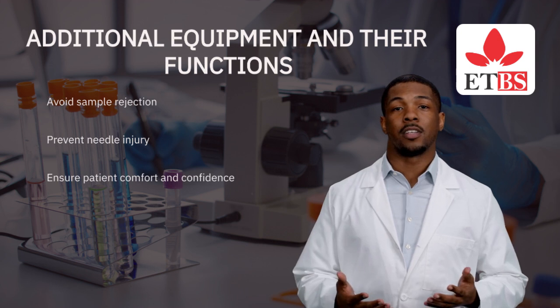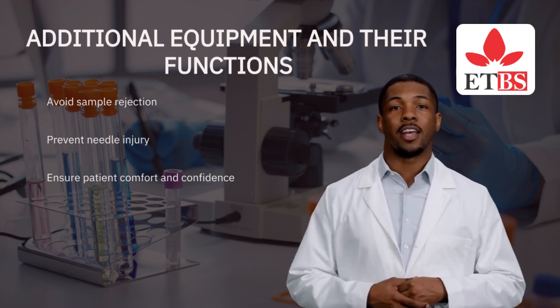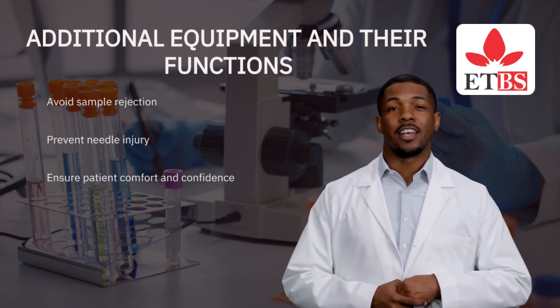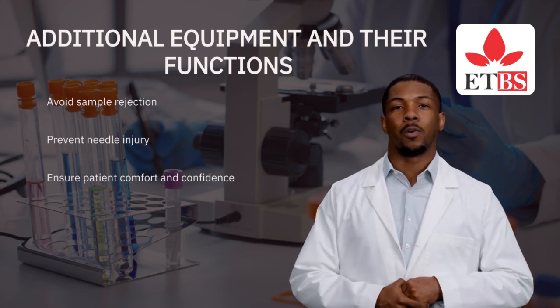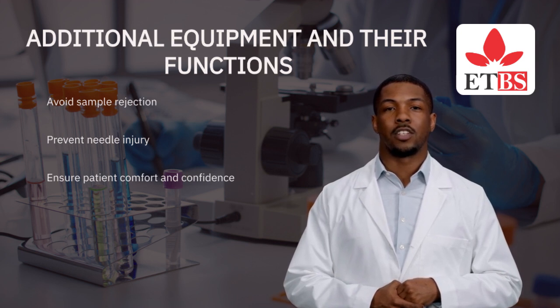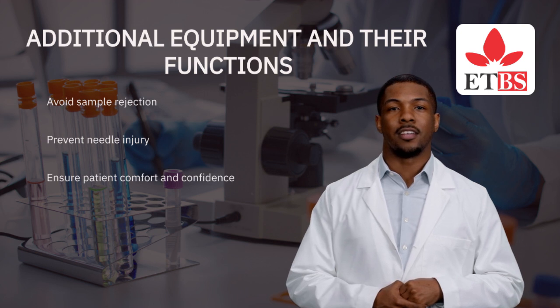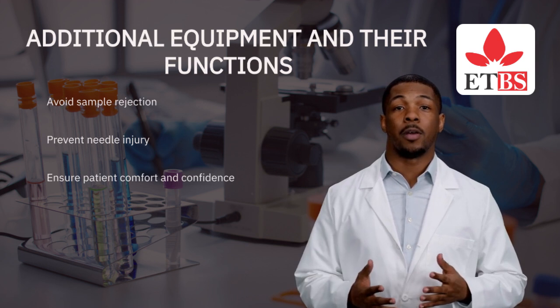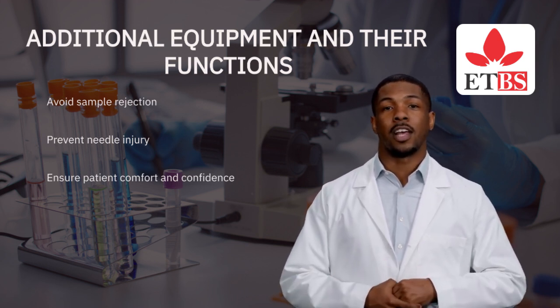4.4 Additional equipment and their functions. Item, function: tourniquet, vein dilation through venous stasis; alcohol swabs, skin antiseptic, 70% isopropyl alcohol; gauze pad, post-puncture compression; bandage, protects puncture site; labeling pens, for identifying specimens; needle disposal, puncture-proof containers for sharps; holder adapter, secures needle and tube during collection.